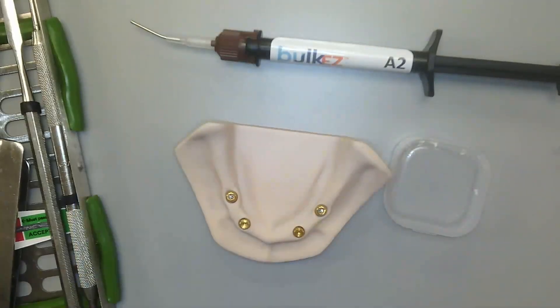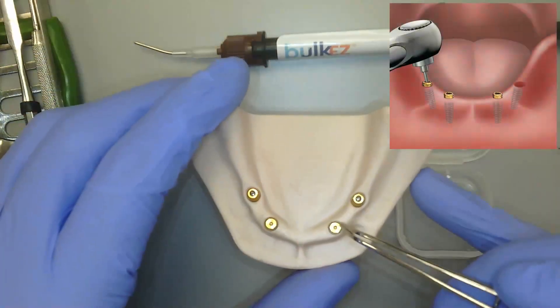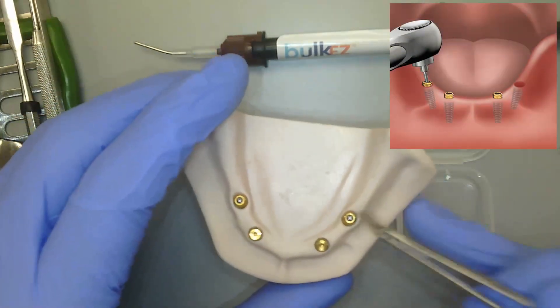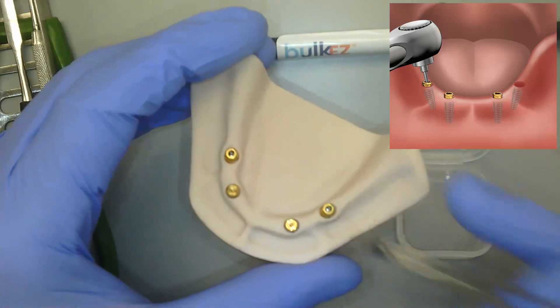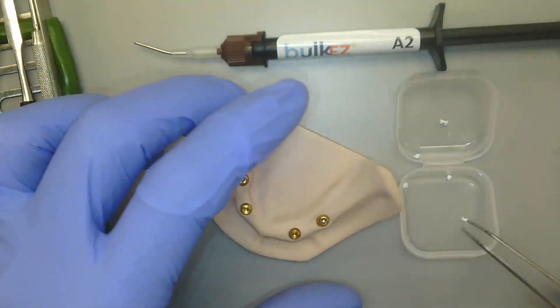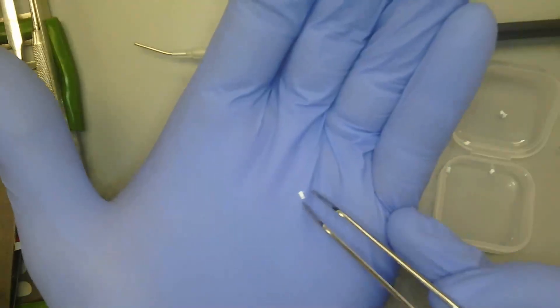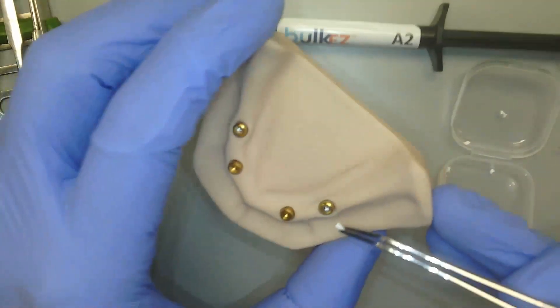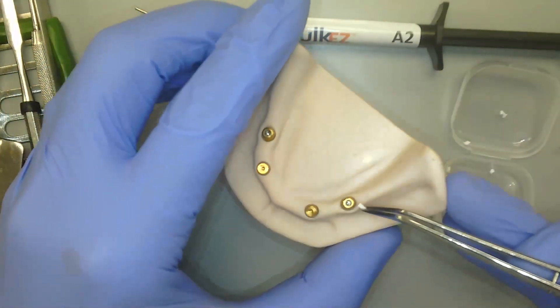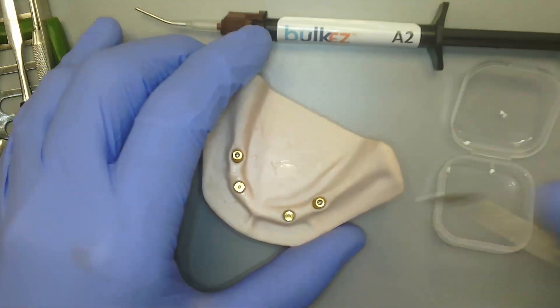I'm going to grab my cotton pickup and one of these pellets. Before we do this, we want to make sure that we've torqued our locator angled abutments down. Prior to torquing, take a radiograph to confirm full adaptation of your implant. Now, I'm going to grab one of these very small pellets — you can see how tiny this is. The tendency is to use a very large PTFE pellet, but I encourage you to use a very tiny one, because you can always add a second if needed.